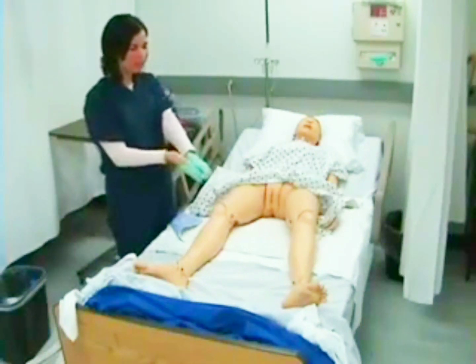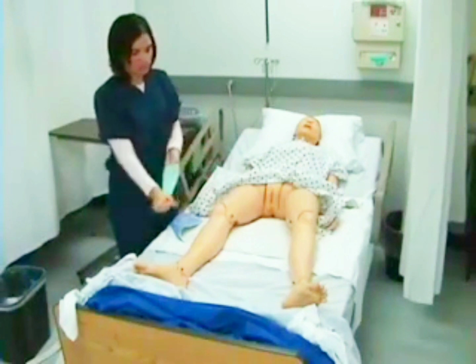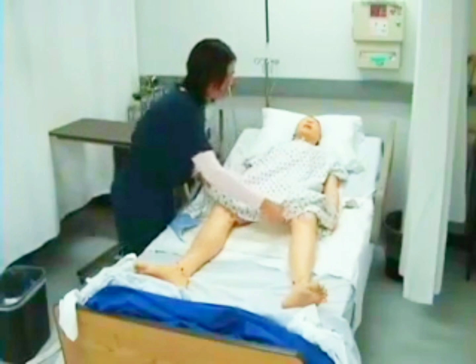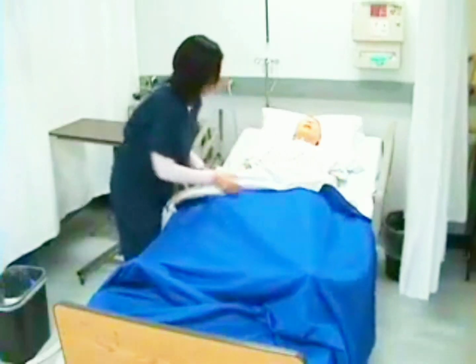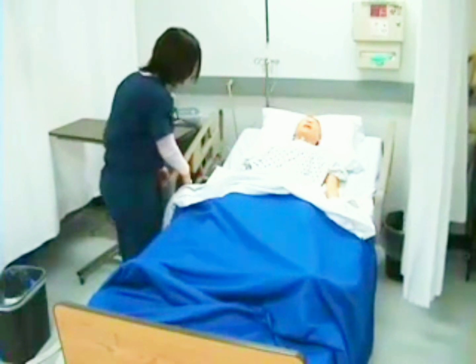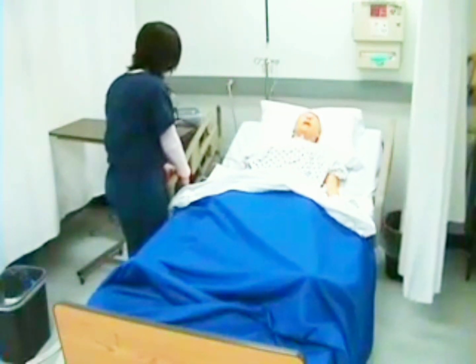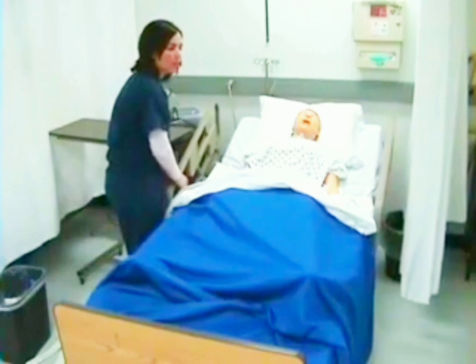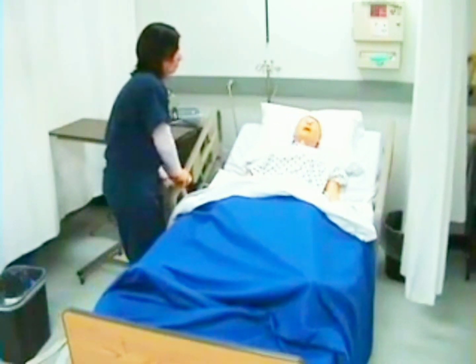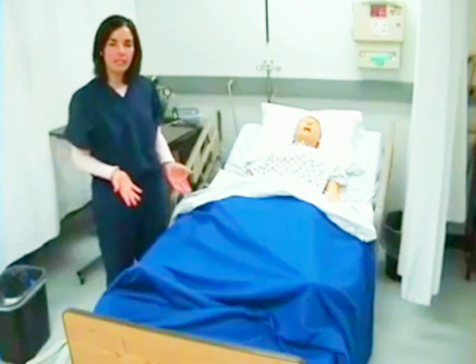I would be able to provide perineal care to my patient or dry with a towel. Now I will dispose of my gloves. I will cover my patient and place my patient in a position of comfort, then lower the bed to the lowest position. Then I will wash my hands.